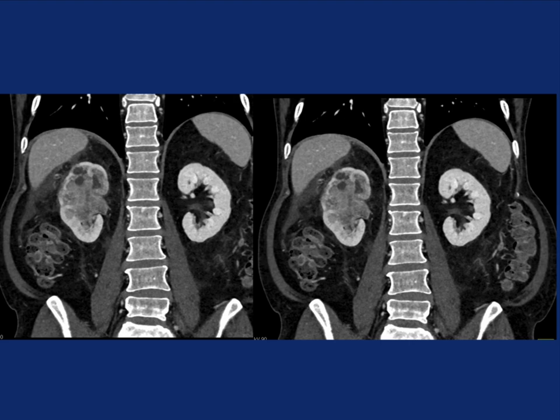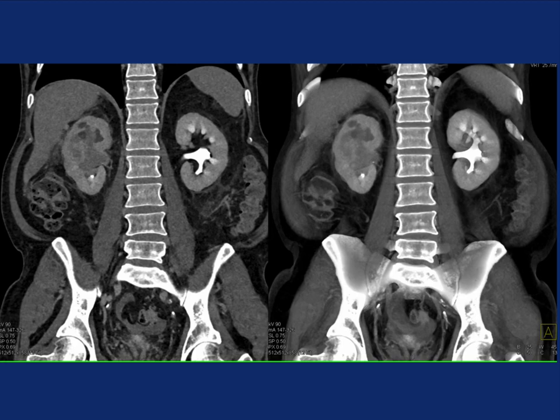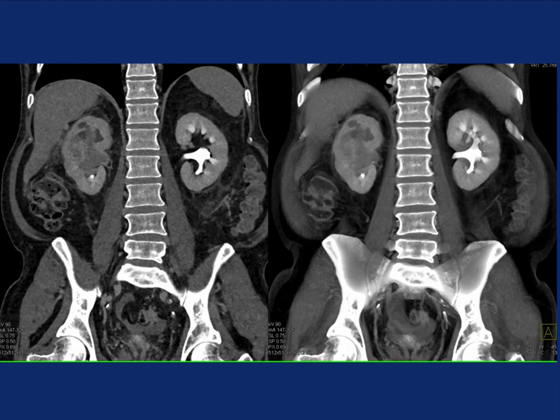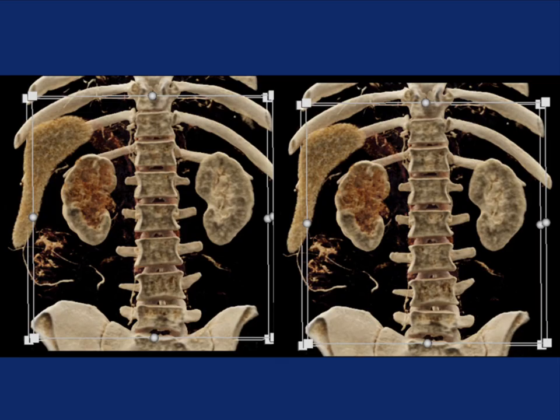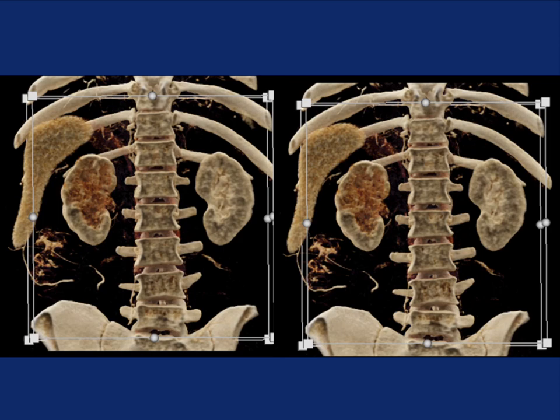I mentioned it could be lymphoma. Lymphoma is usually bilateral, usually bulkier, but a lot of nodes are present — this could be lymphoma, couldn't argue against it. Here's the excretory phase imaging where you're seeing the lack of contrast opacification of the lower two-thirds of the calyces of the patient's right kidney; the left kidney calyces look okay. With cinematic rendering, that infiltration and tissue texture mapping is very nicely shown, well-defined in this case.